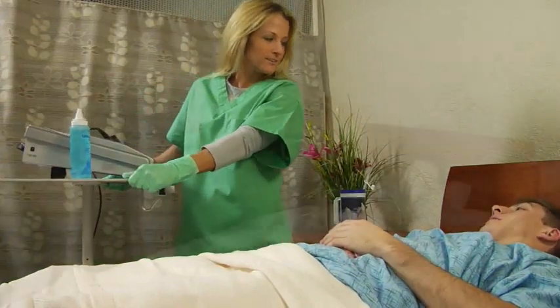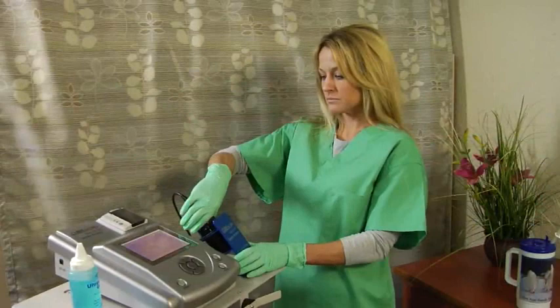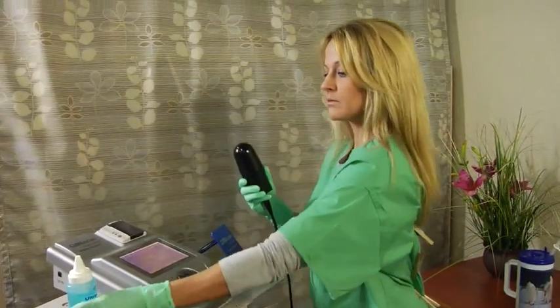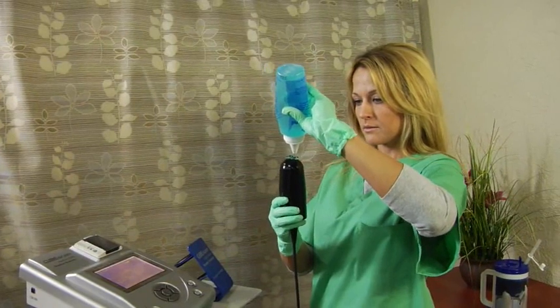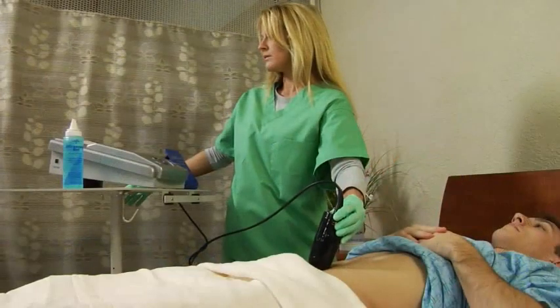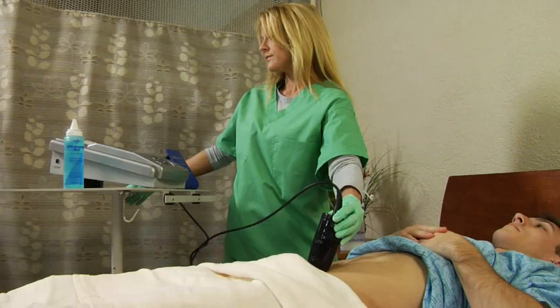The Biocon 500 requires little training. The portable unit is wheeled to the patient's bedside, and the clinician applies ultrasound gel to the patient's lower abdomen. The device's probe is then positioned over the bladder area.